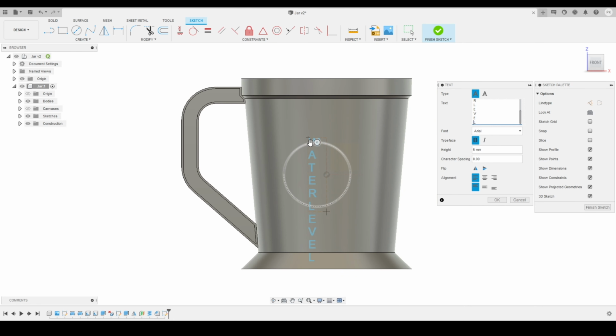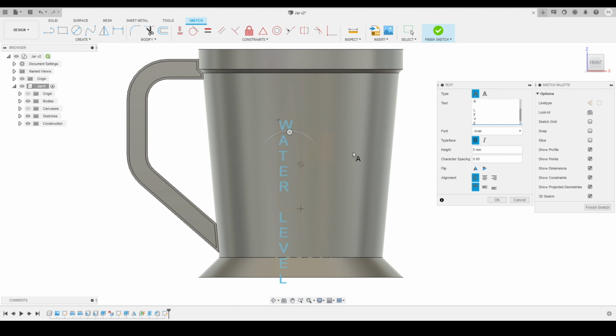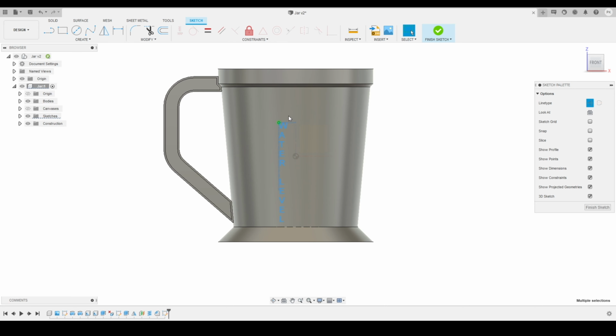Here you can see, so this is what we got, this text water level. And once I am done with this, I can just press OK to accept the results. So I will just give it a space between the water and the level. Here you can see I had just given a space, and I will make sure that the height is also good. So I had decreased the height a little bit, and will press OK to accept the result. Now I can select this text and move it inside the space if I want. And here you can see these are the points, this is the text box that is being defined by Fusion 360. So I can drag this box and adjust my text anywhere inside the space.